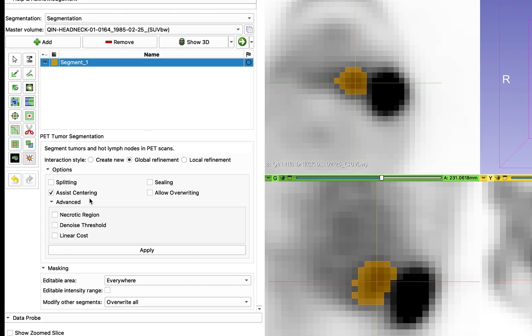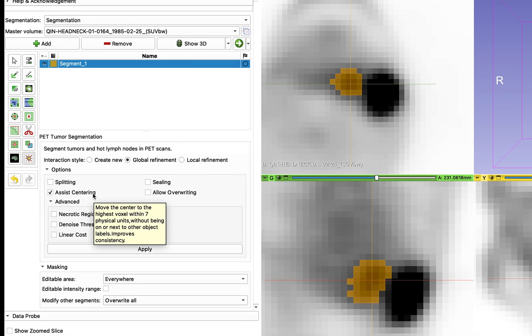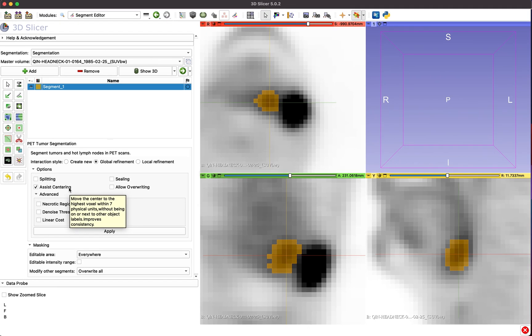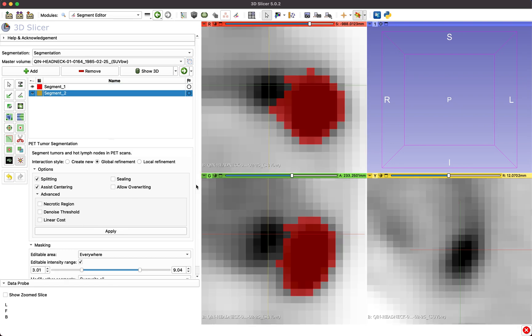Assist Centering, which is enabled by default, helps locate the lesion center by moving the center to the highest voxel within a 7mm range of the user click, without being on or next to another segmented object.